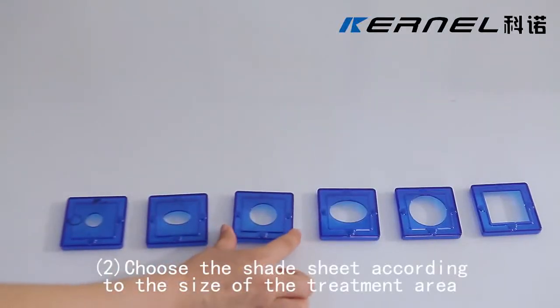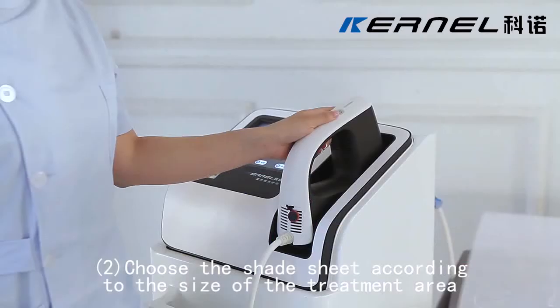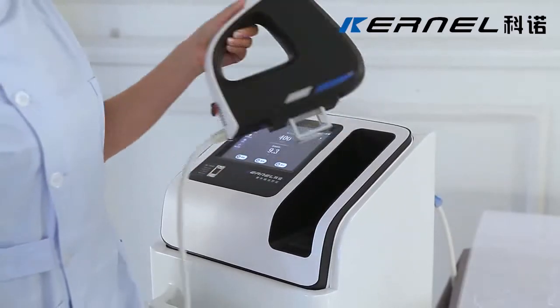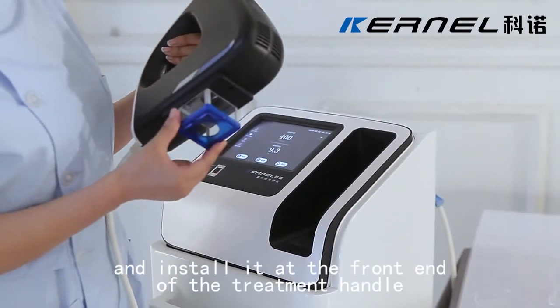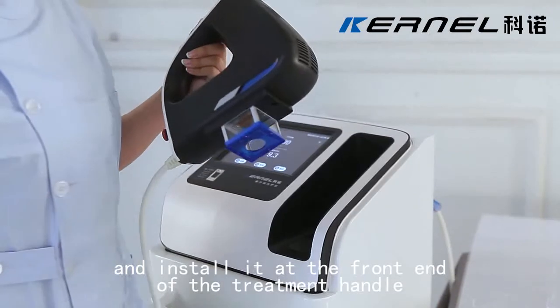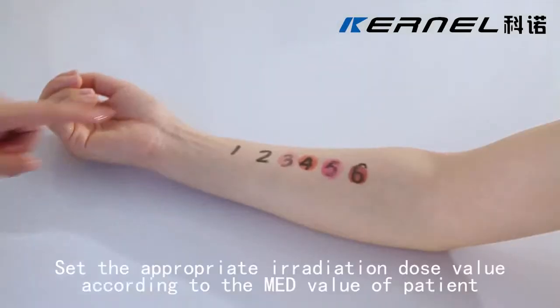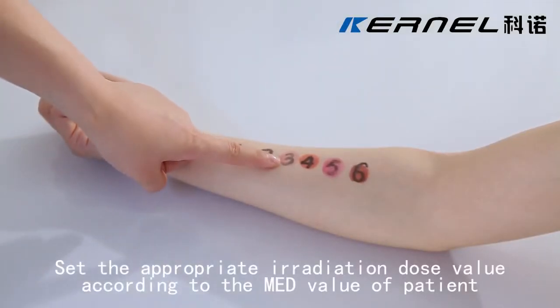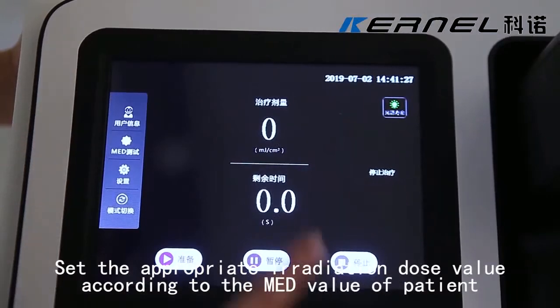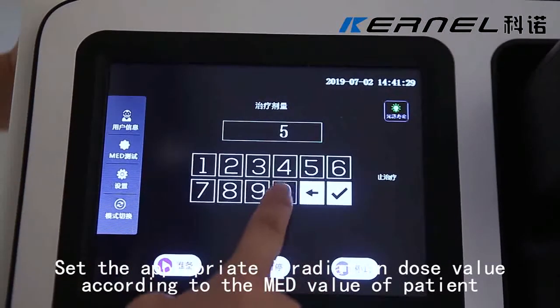Step 2: Choose the shade sheet according to the size of the treatment area and install it at the front end of the treatment handle. Set the appropriate irradiation dose value according to the MED value of the patient.